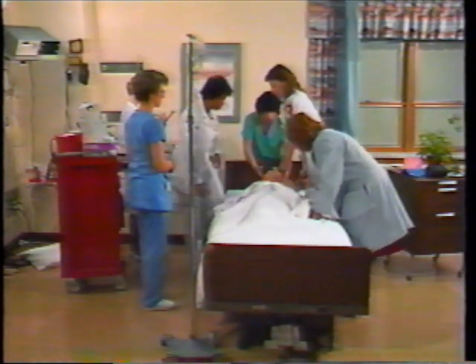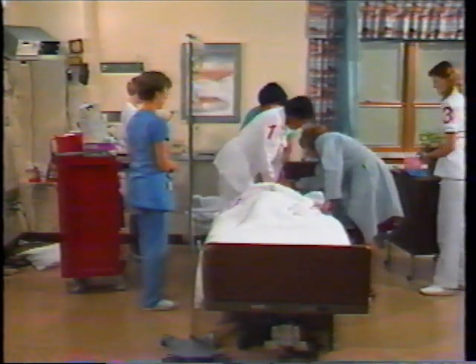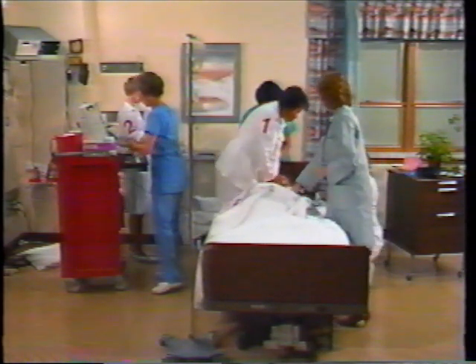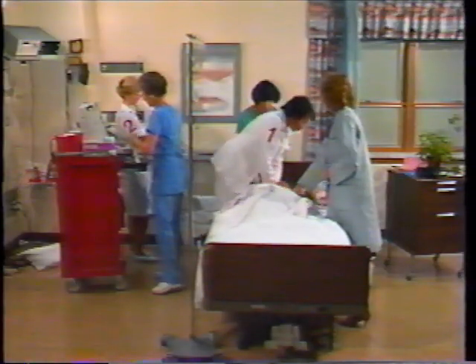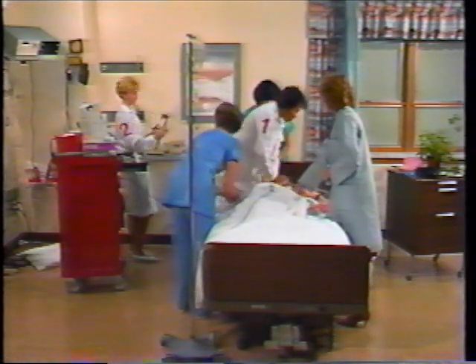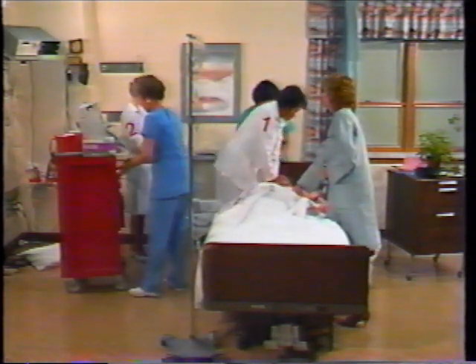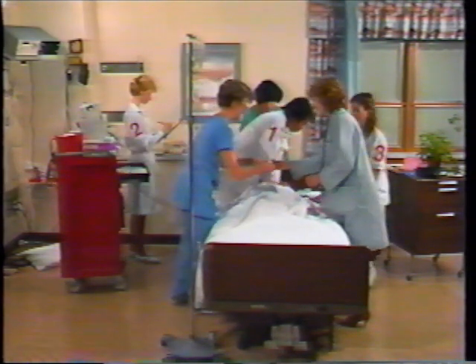Change. 1 and 2 and 3 and 4 and 5. Good bilateral breath sounds. Give her 1 milligram atropine IV push. 1 milligram of atropine IV push. You want to give me a syringe? I'll get some blood gases.